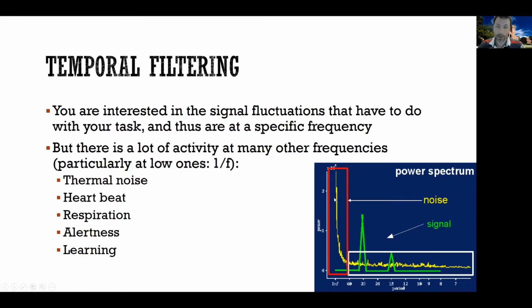Now this noise, because it's so-called colored, meaning it's not the same across all frequencies, as you can see, it changes. It's more powerful at low frequencies, right? The low frequencies are on the left, high frequencies are on the right. So the colored noise has what's known as a 1/f profile, so 1 over the frequency profile. Really powerful at the low frequencies and then slowly decreases as you go towards higher frequencies. Now this noise we have to address. We have to somehow clean it.